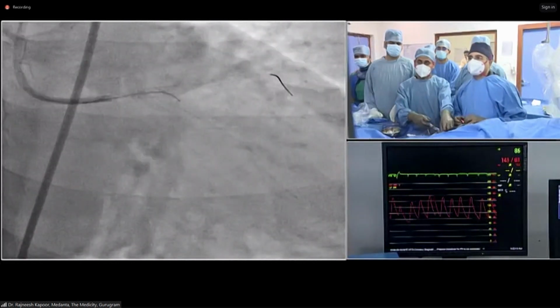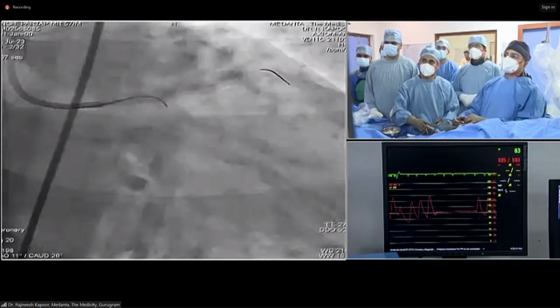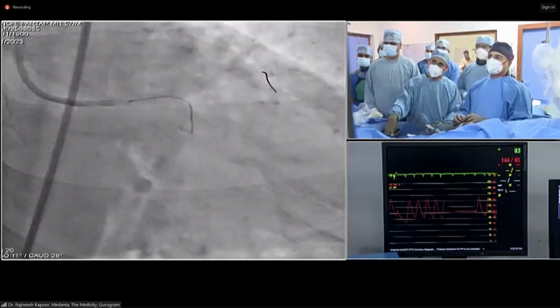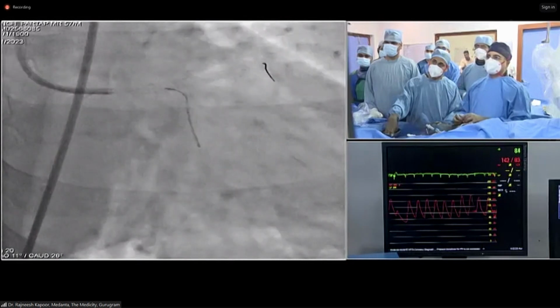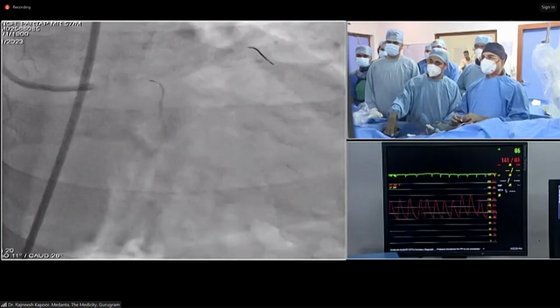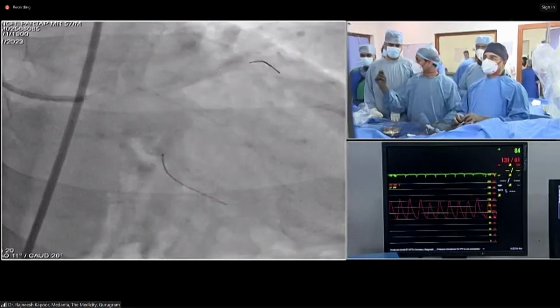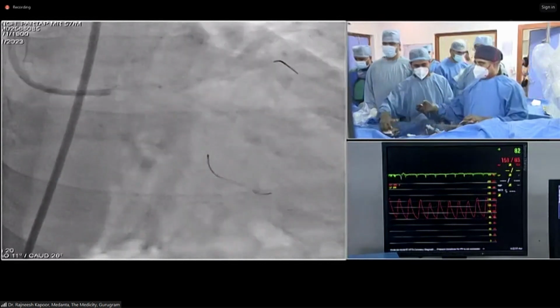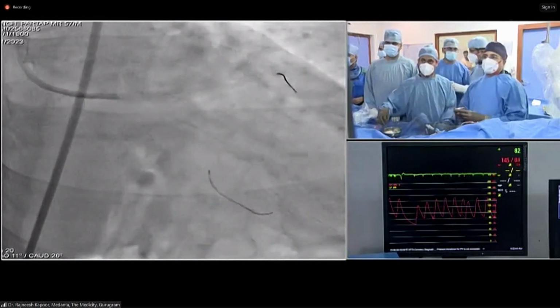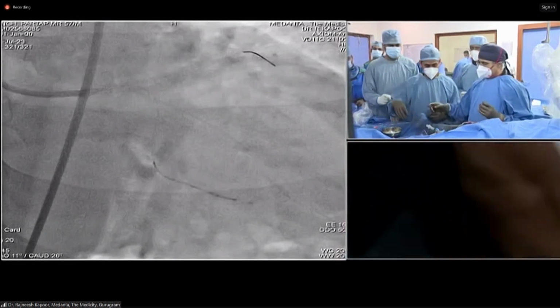How is your correlation between the IVUS and stent boost? This is a more proximal cell, and that is exactly what the expert wanted, that we should go from more proximal. We have gone through that, and let's have kissing balloons once more. 2.75 taken, and maybe 4.0 this time. 4.0 is here already. Okay, so we are ready for the second case and then POT after that, and if time allows, we'll show you the imaging.